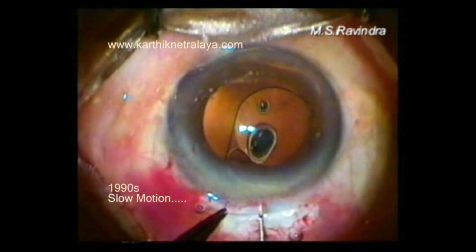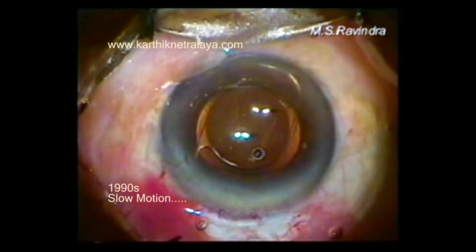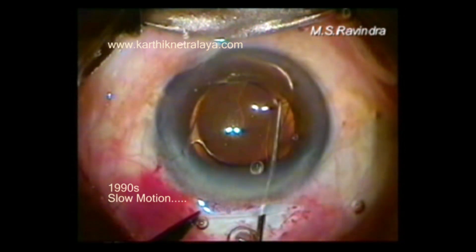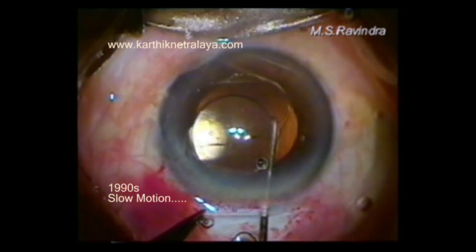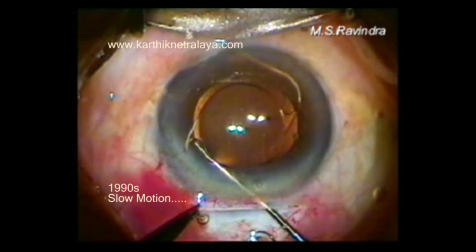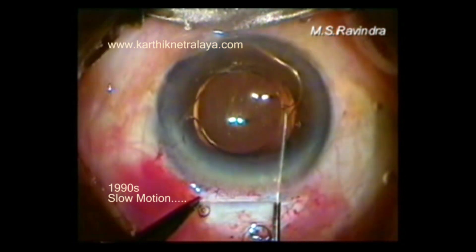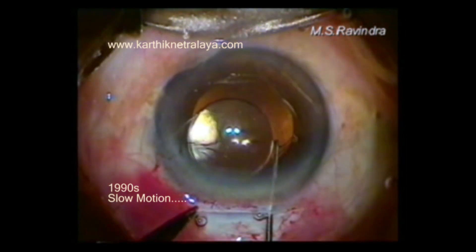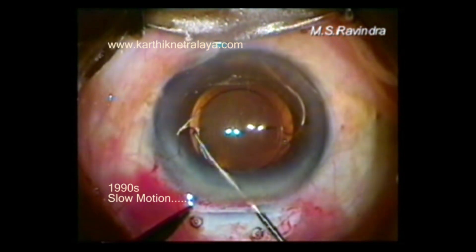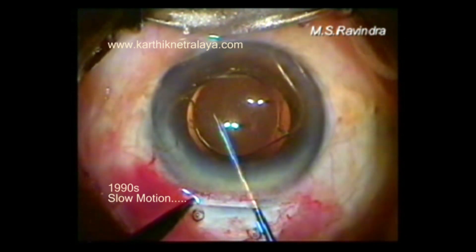A tunnel of six millimeters is essential. After that, I like to implant the lens horizontally at all times, because the squeezing action when the upper lid is pressing on the globe can cause tenderness for a couple of weeks if it is implanted vertically with the long axis vertical. So I would always rotate it. I would have liked the pupil to be a little smaller than what you see here. This is the way I withdraw it from the angle region and very slowly position it, alternating each haptic so that it doesn't drop against the angle region.